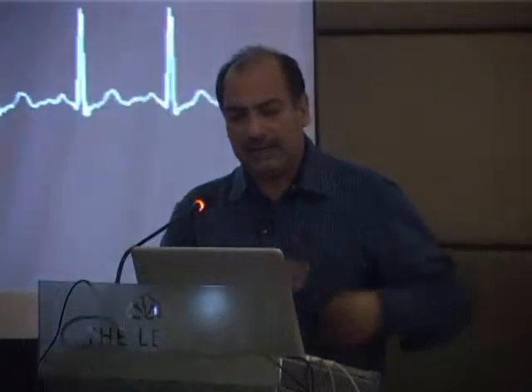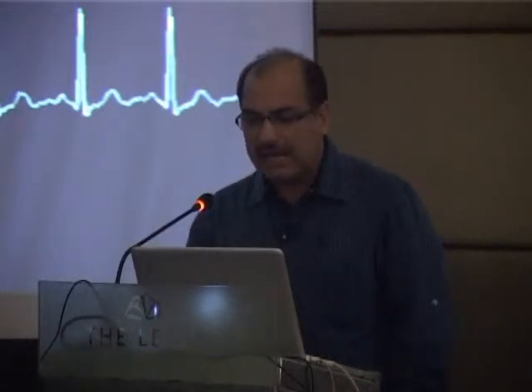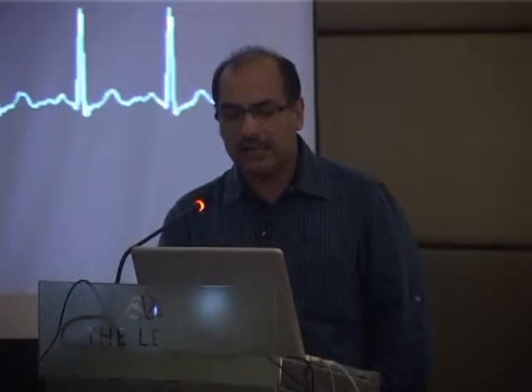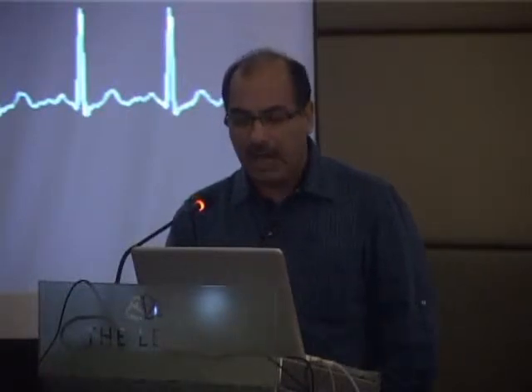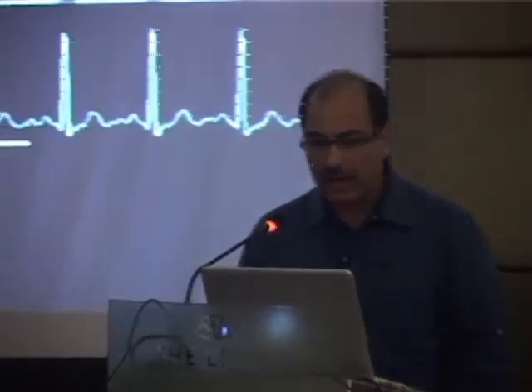High heart rate. If we look at high heart rate, this is a patient with a heart rate of 88 to 95. And you can see absolutely beautiful coronary artery pictures of the RCA, the LAD, and here's the ECG. I'm going to show you ECGs as we go along, and these ECGs that you will see are taken during the scan. Where you see these vertical boxes, those are where the scan is on. So I'm just proving to you that we're not faking it, that this is actually the heart rate when we scan the patient.